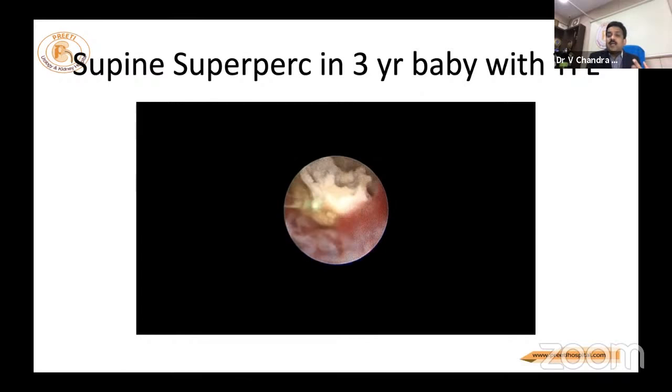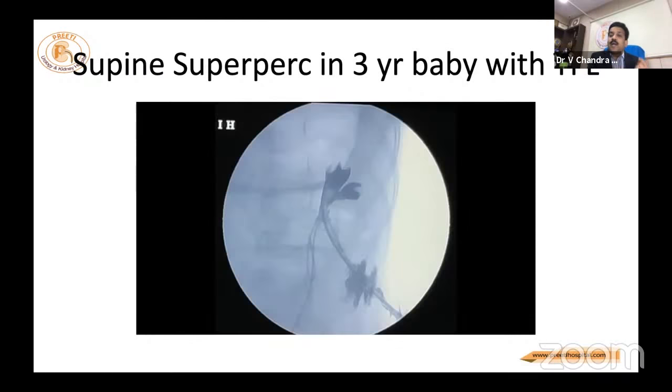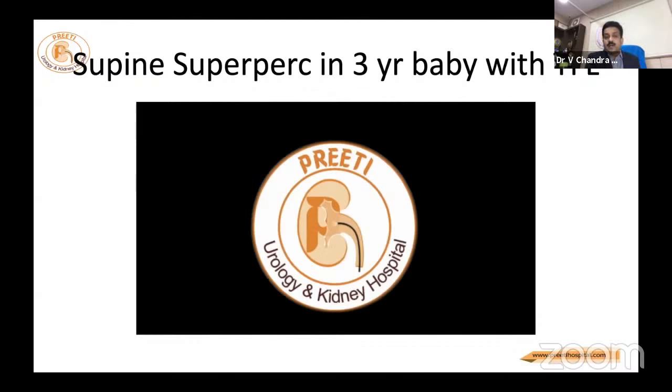At the end, when the surface area is same, volume is less, those fragments can be sucked out by the instruments what Mahesh Deshasar is telling. But if volume is more, they cannot be sucked out.